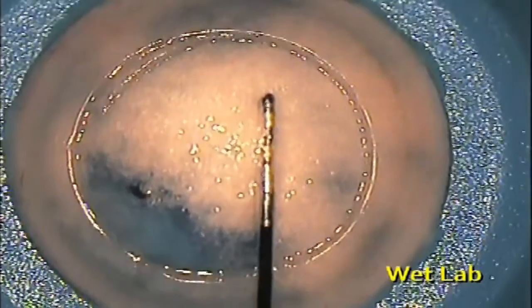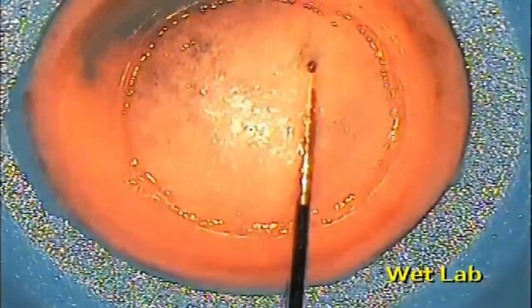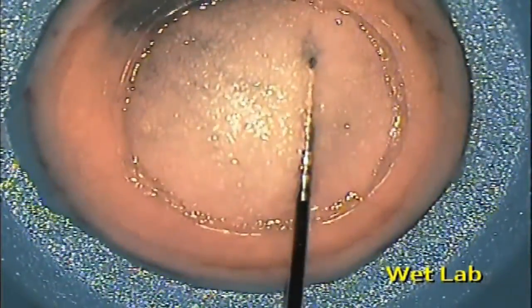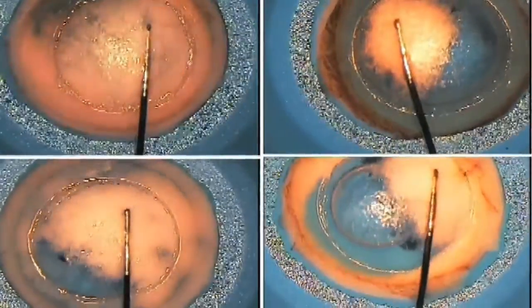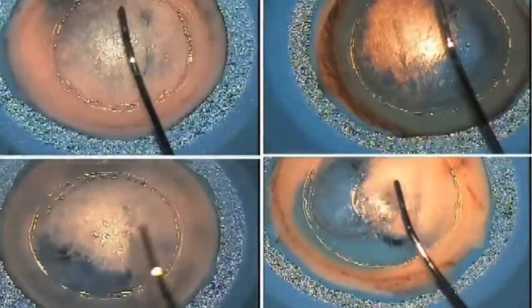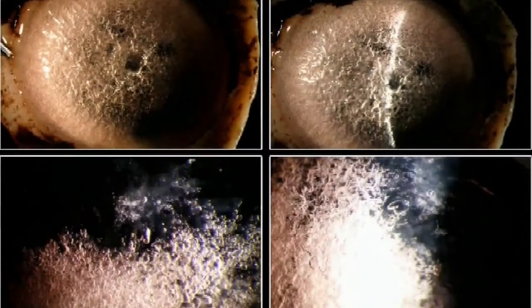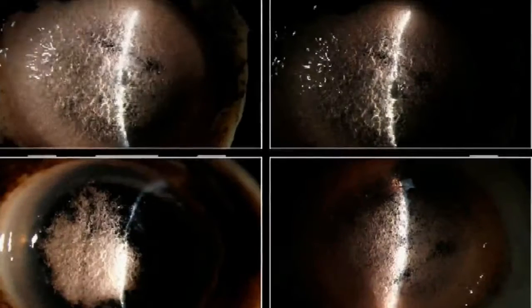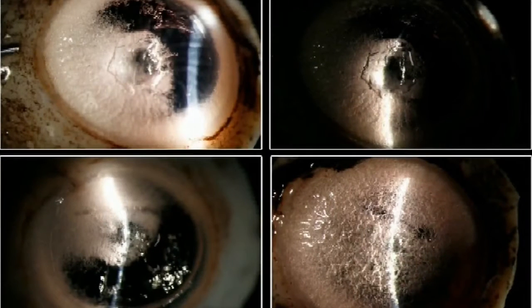In the wet lab, we studied extensively the failure of formation of the big bubble. We tried to understand what happens at the deeper layers of the cornea and what changes take place there. We also thoroughly observed the changes occurring at the posterior surface of the cornea. We noticed multiple tiny bubbles of various sizes at various depths of the cornea.